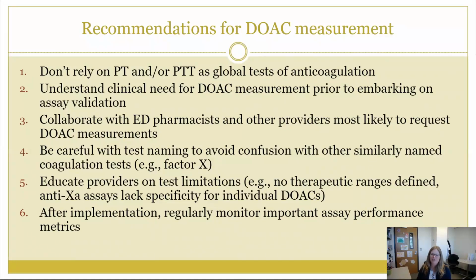So my recommendations for measuring DOACs, the first one is you cannot rely on the PT and the PTT as global tests of anticoagulation. The most common DOAC that is prescribed these days is apixaban, and most PT and PTT reagents are not at all sensitive to apixaban. So that is really important to understand and to relay to your providers.